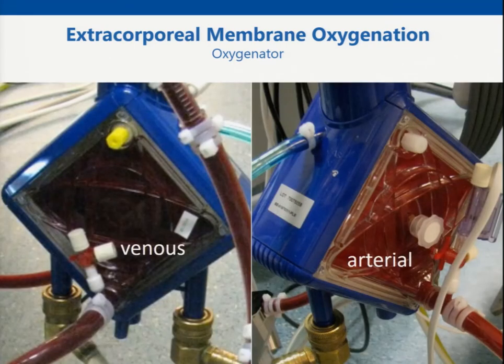So this is how it looks at the bedside. So you can see here the venous blood, which is of course dark, and the arterialized blood is of course light red. And you can see here the tube that is providing the gas mixture, oxygen, air, and in extraordinary situations also CO2, but in adult ECMO this is a combination of O2 and air. And for CO2 removal, you will later see that you could opt for a single O2 gas flow only.